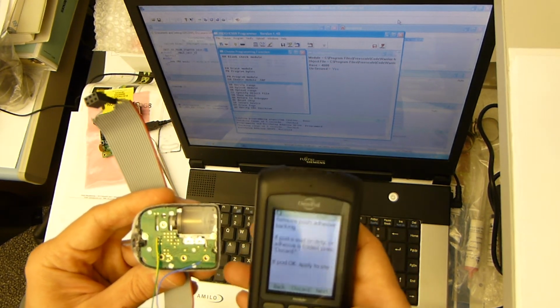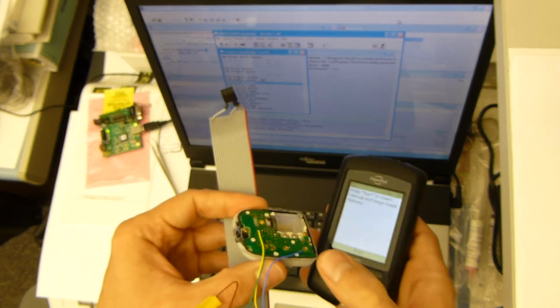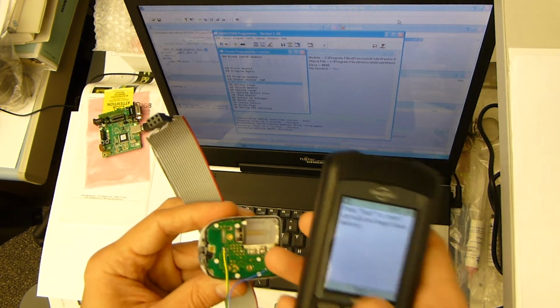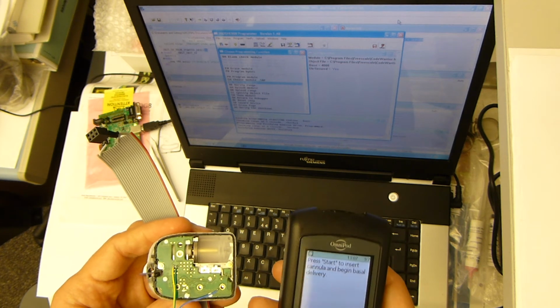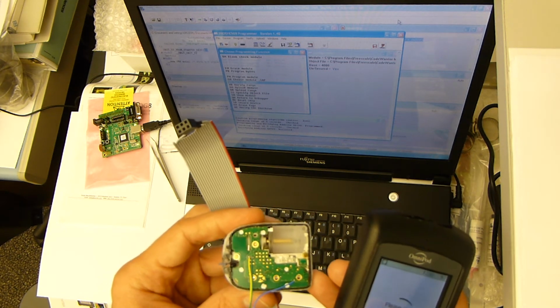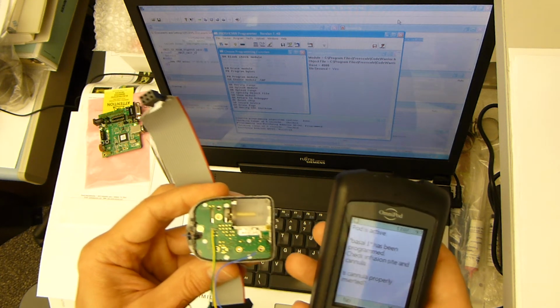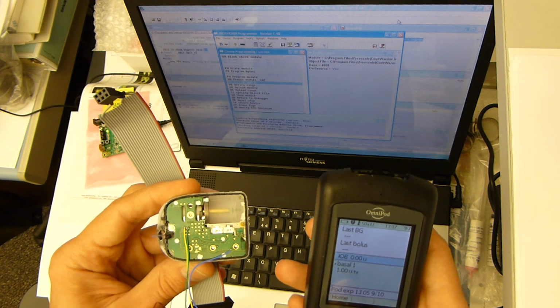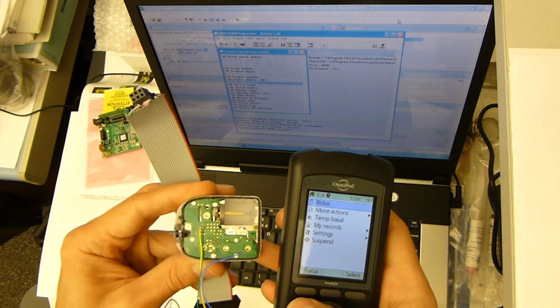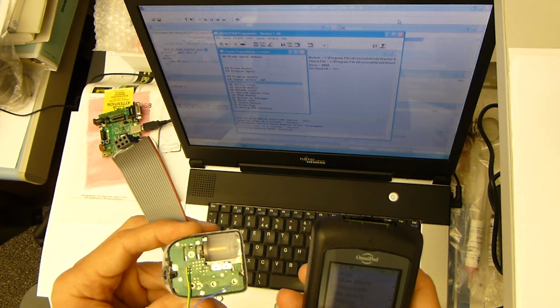Okay, what's next? Now the pod is ready for the cannula insertion, but because it's a used pod, we cannot restart the cannula insertion process because the mechanical mechanism inside the pod is one-time use. So we just press the start button so that the software inside the pod thinks that the mechanical part is working. So a few more turns of the gears and the pod should be ready for normal operation. So we say everything is okay. So now it's in full operational mode and back in life. So you can see by reprogramming the firmware back to its original state, the pod can be reused and the software works as if it was a brand new pod.